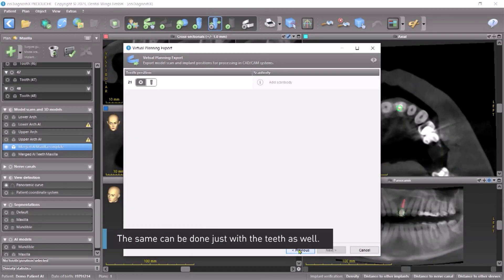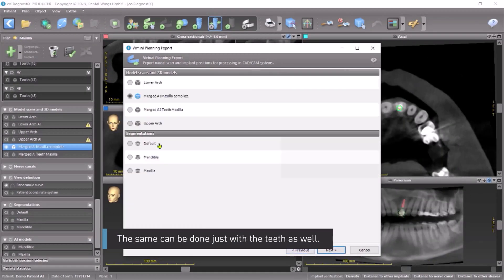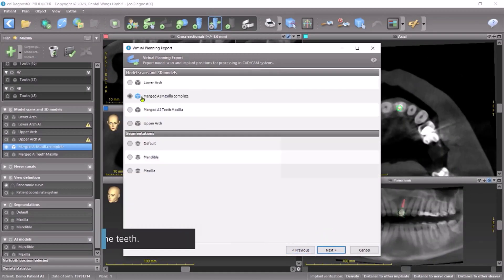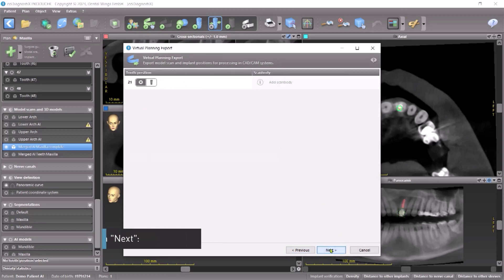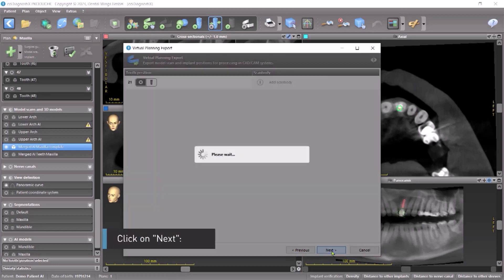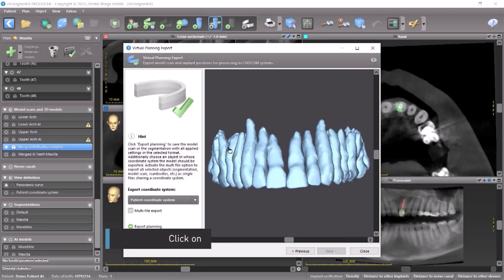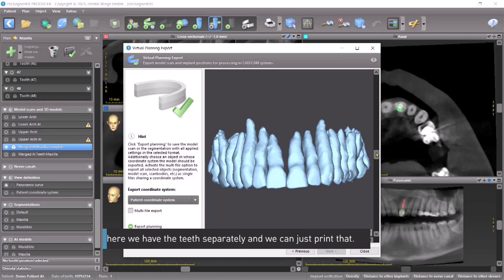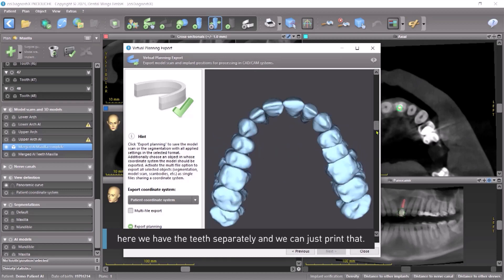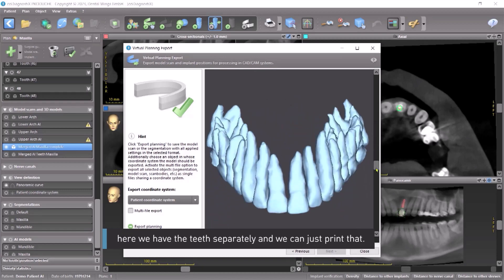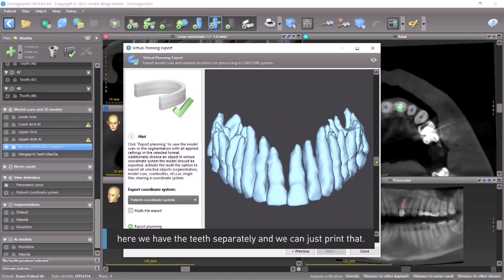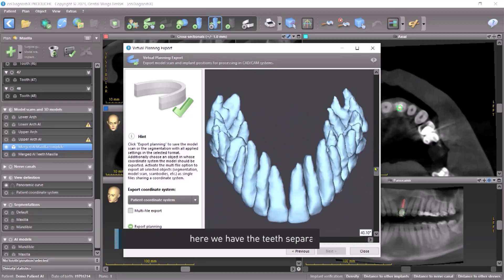The same can be done just with the teeth as well. We have the teeth — click Next. Here we have the teeth separately, and we can just print that.